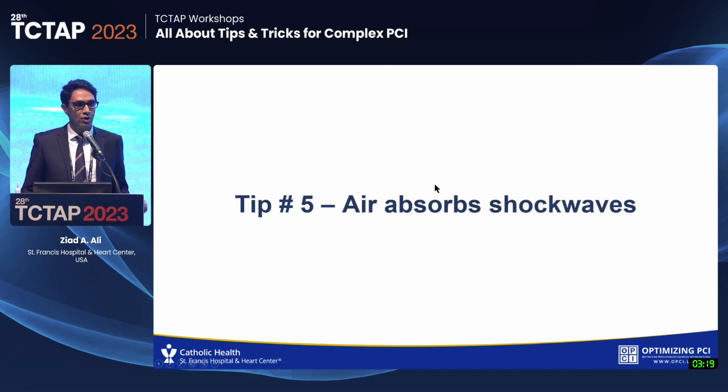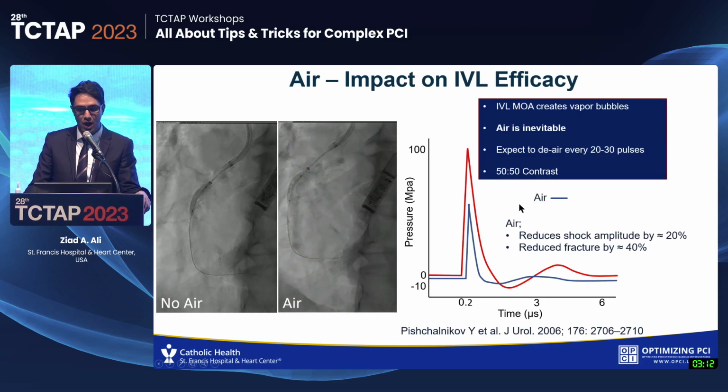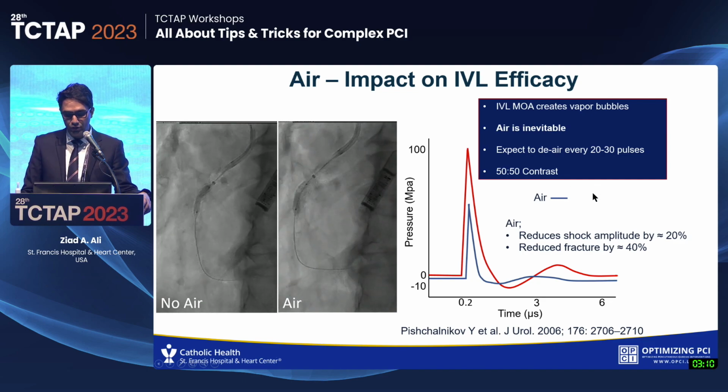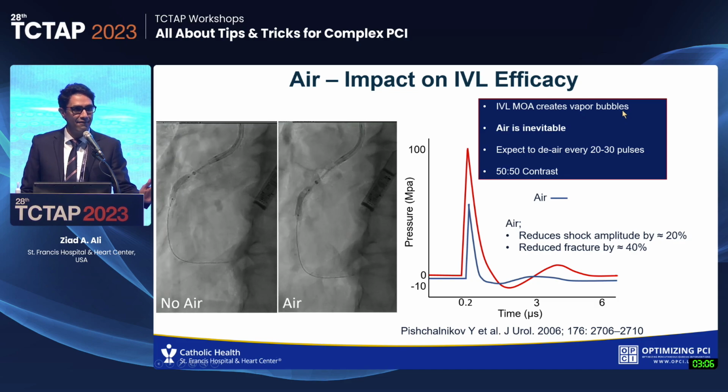Air absorbs shock waves, just like an airbag absorbs energy. If you have air in your balloon, it will reduce the efficacy of your shock amplitude by 20% and reduce your fracture by 40%. Remember, air is inevitable with IVL.